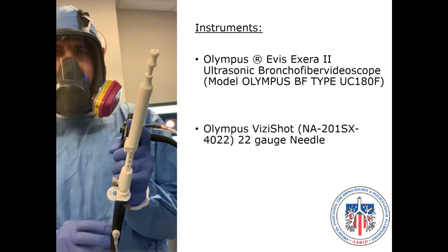This video will demonstrate the jab sampling technique used during endobronchial ultrasound guided transbronchial needle aspiration. We will be using the Olympus Evis Exera II linear EBUS bronchoscope and the Olympus ViziShot 22-gauge EBUS needle.